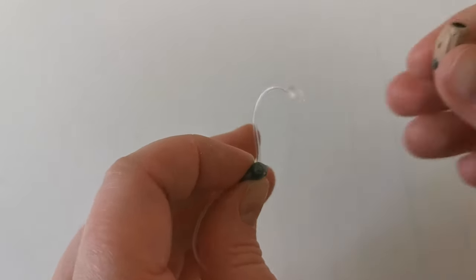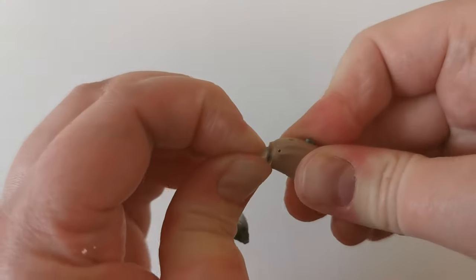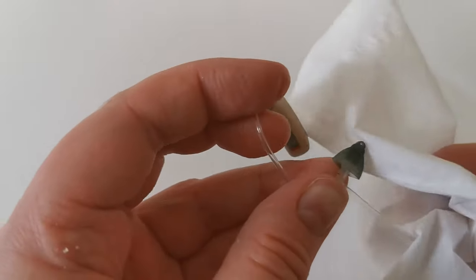You then reattach the tube by turning it clockwise into the hearing aid. If there is any debris left on the hearing aid or the dome, clean it using a tissue or a wipe.